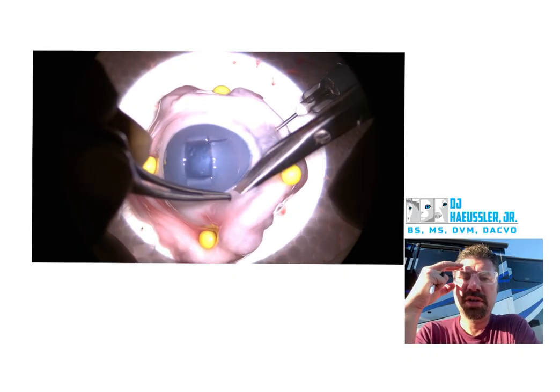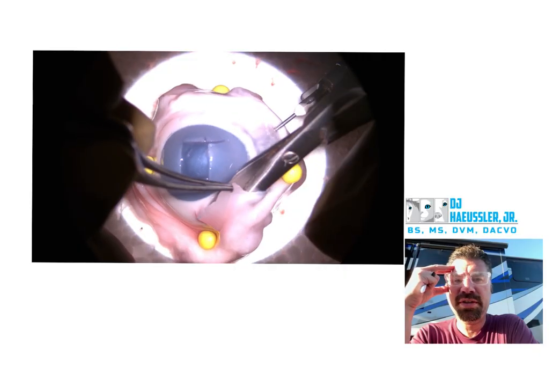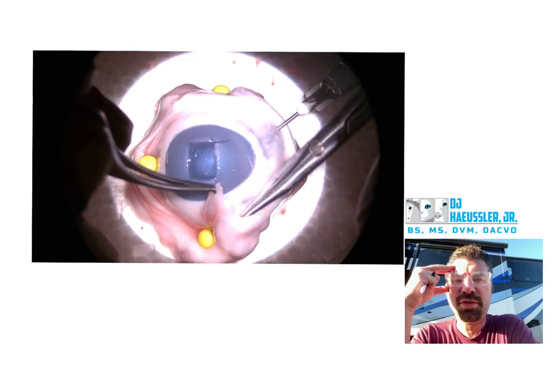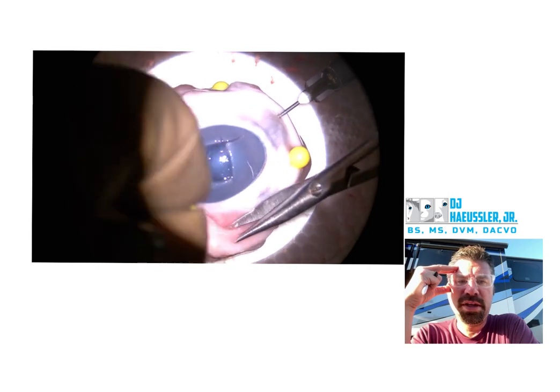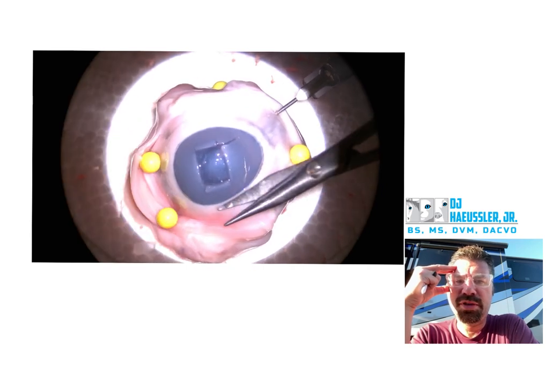Much better job on your undermining than in previous. You should still go a little bit further, but overall a big improvement. It's got a lot of Tenon's there. Good job moving your needle — that's great.